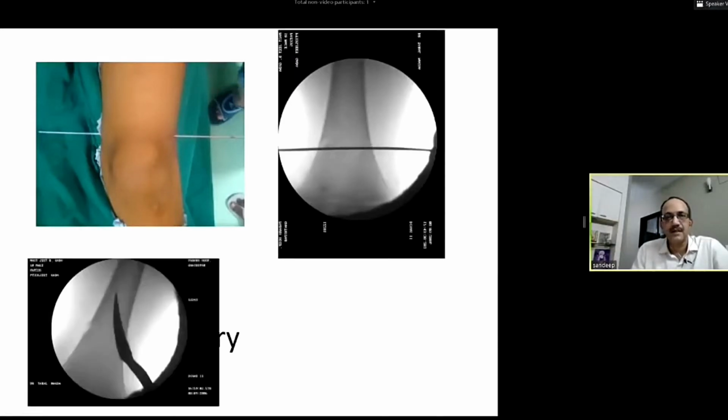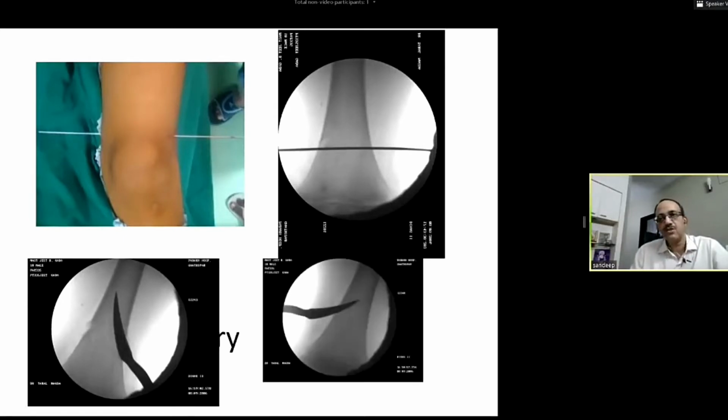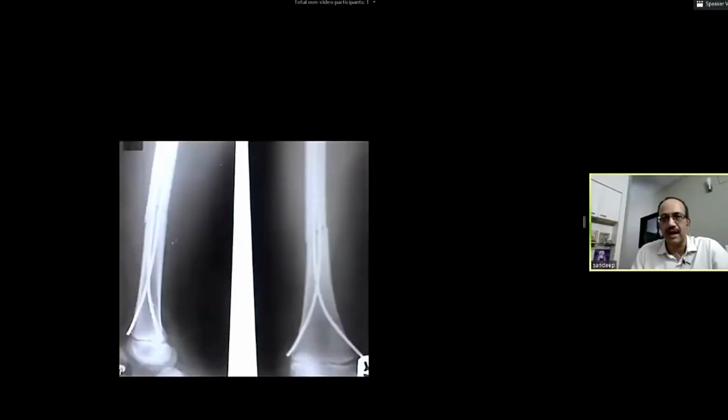Something like this. So you enter with a straight awl and then make an adequate channel with a curved awl to enter the canal adequately, right, from both the sides. So a symmetrical entry point about 2 finger breadths proximal to the physis, which lies at the superior pole of the patella as a surface marking guide.